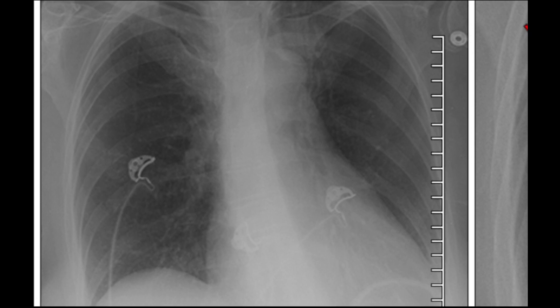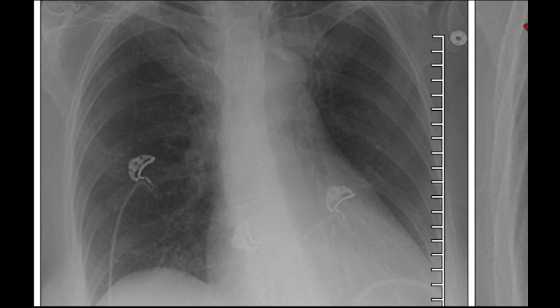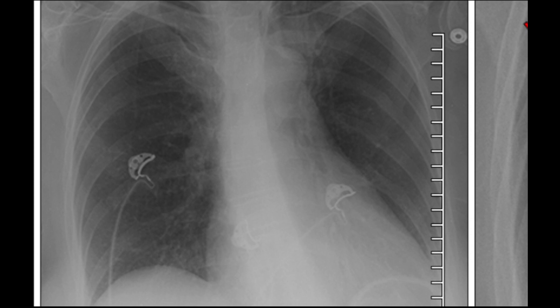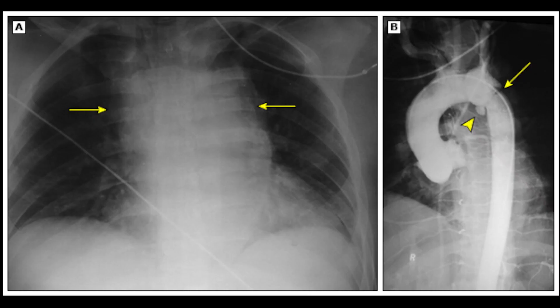There actually appears to be a fracture in three of them. This is a chest radiograph from an 80-year-old female who complained of chest pain following a trauma. There are non-displaced posterior fractures of the right-sided ribs six, seven, and eight noted. One of the main complications of rib fractures is pneumothorax, which does not appear to be present here.